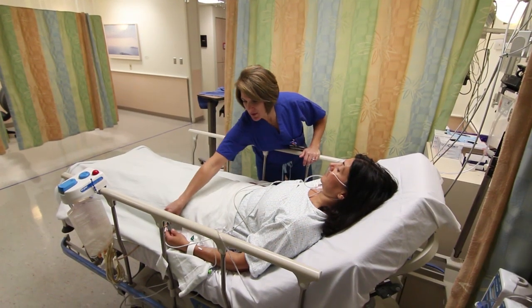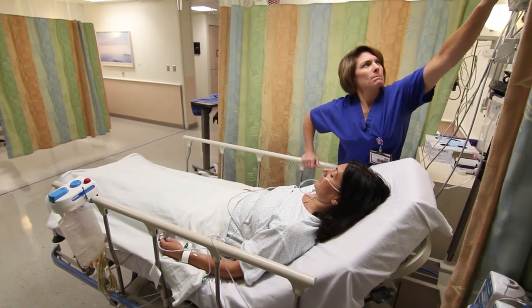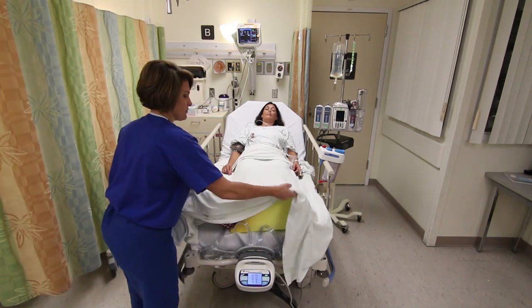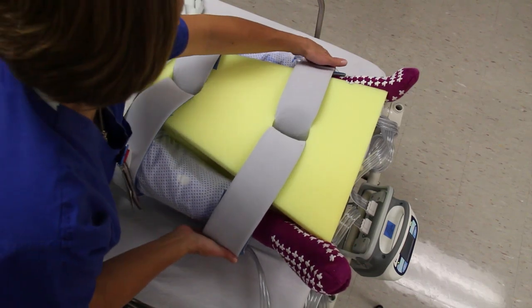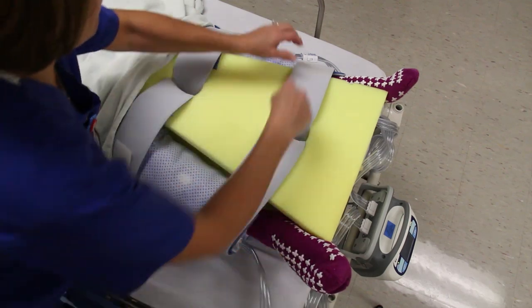Before you left the operating room, the surgeon attached equipment that will aid in your proper recovery. Your surgeon will decide what equipment is best for your recovery. Do not be concerned if another patient has different equipment. These may include the following. A wedge is used to separate your legs and remind you not to cross your legs, which could result in hip dislocation. In recuperating from surgery, there is a tendency for blood to pool in the calf area. Your surgeon may want to use the device to limit the risk of deep vein thrombosis, DVT, or blood clots, and edema, swelling, while your mobility is limited.